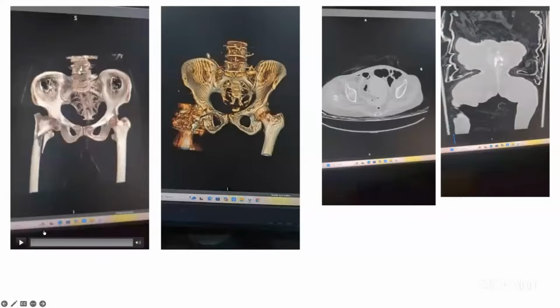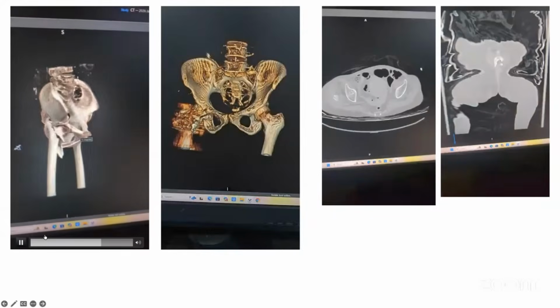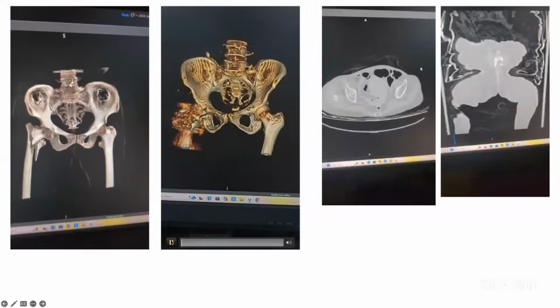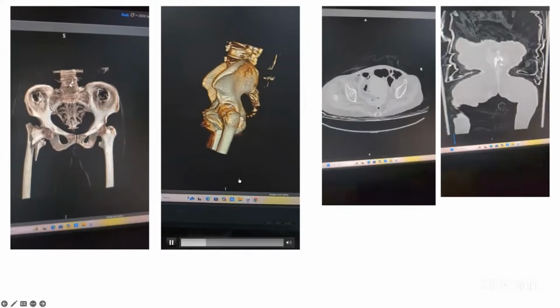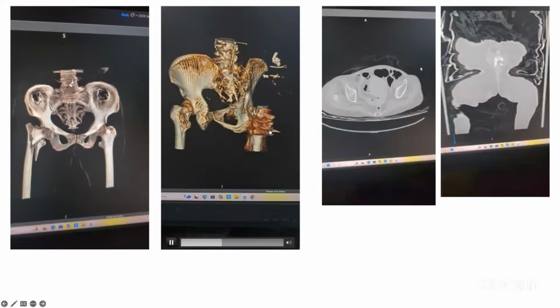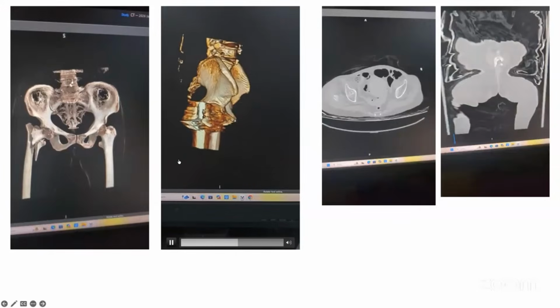This is another patient with an intertrochanteric fracture with a long posteromedial beak and trochanteric combination. Whenever a greater trochanter fracture is there, we always tend to go through this fracture line and produce a wedge effect. After fixation of this fracture by the nail, you can always see that there is an exposure of the implant on the lateral side when it is reanalyzed by the CT scan. You can see there is very poor hold of these screws on the lateral cortex.